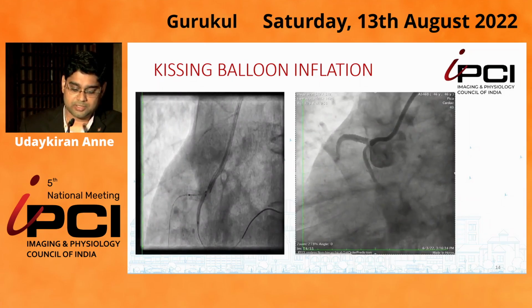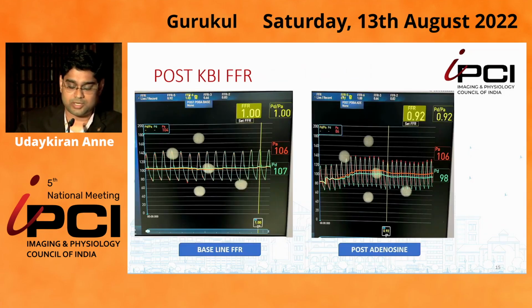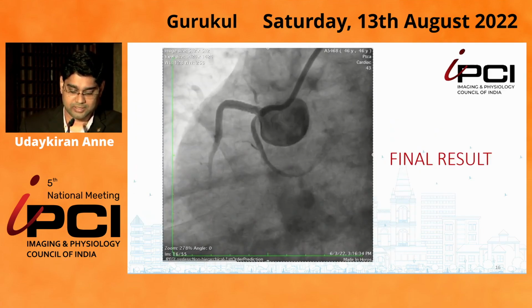Once the kissing balloon inflation was done, her chest pain came down and the ECG settled down. Then we did a post-kissing balloon inflation FFR. It was 0.92. So this was the final result.